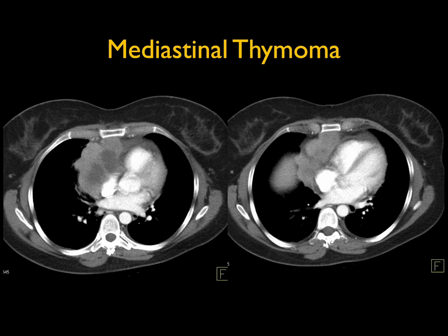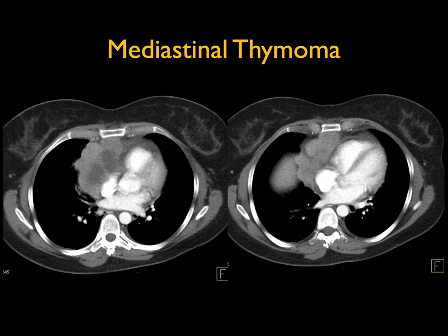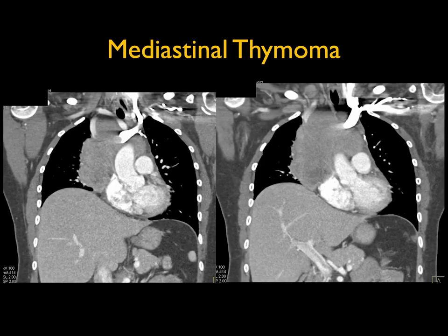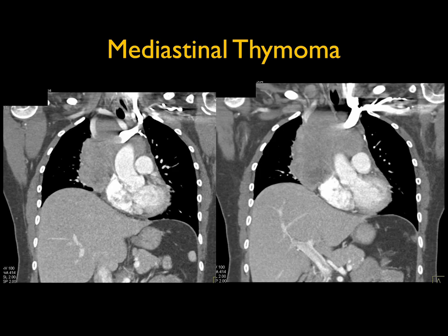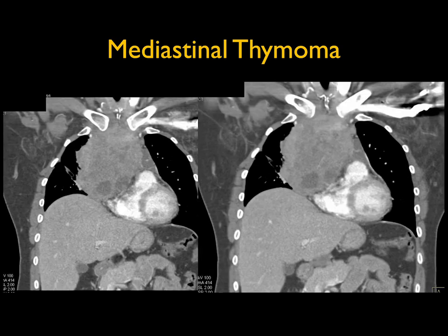Thymic tumors — you can think of thymolipoma, which is fat density, or thymic cysts. Thymic carcinomas can be very aggressive and look similar to thymomas. This was a great example of a thymoma, here shown in coronal display. Solid, eccentric, anterior mediastinum — think thymoma.